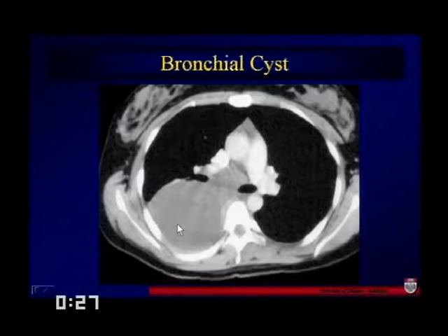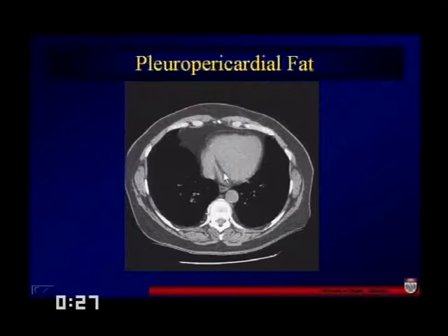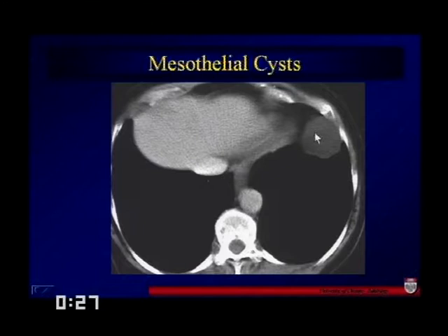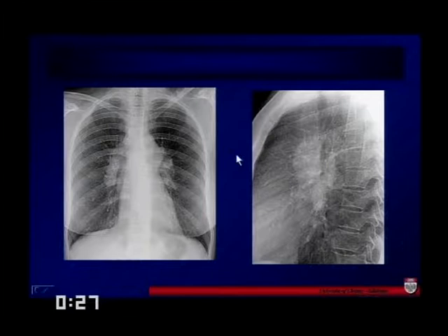This here is a pericardial fat pad — technically called a pleural pericardial fat pad, most commonly seen on the right side. And over here is a pericardial cyst, which can look very similar to the pericardial fat pad. Usually the difference in density is what's going to tip the scales.